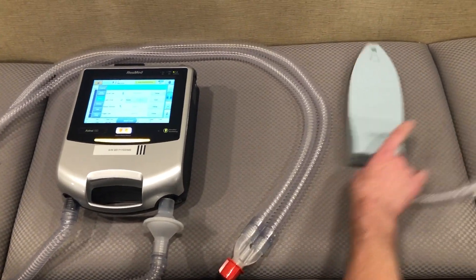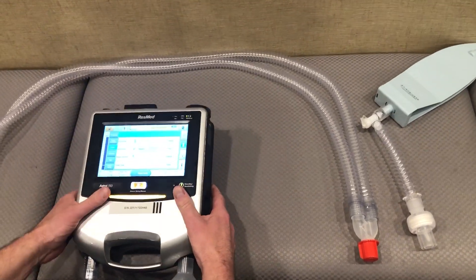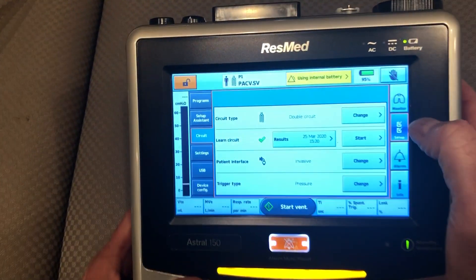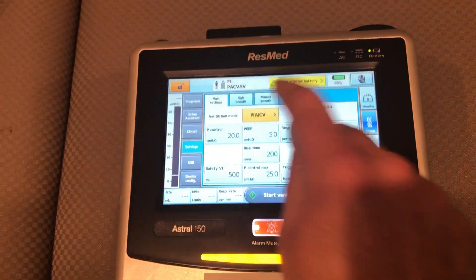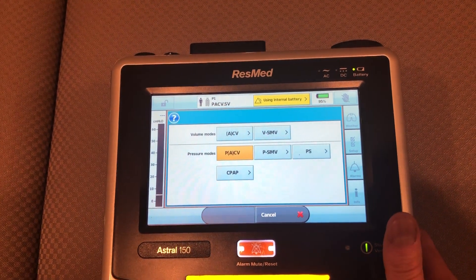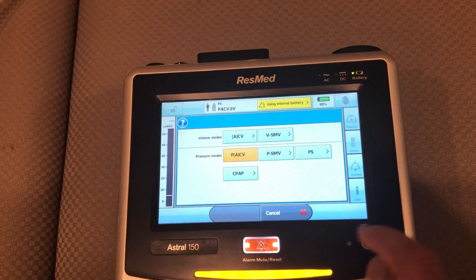Again, we want to do an invasive setup. So I'm going to go into my settings and choose the mode of ventilation. You'll note that we have both volume modes and pressure modes. For this particular patient, we're going to choose a pressure mode.